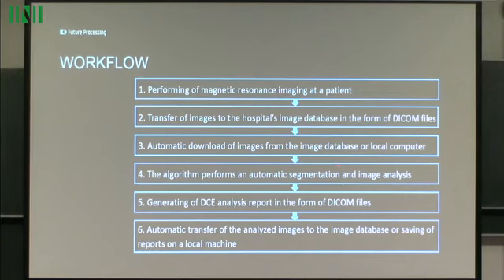After acquiring the data, we want to process the data and we want to do it in place, so in the hospital. No transfer of data, as Lawrence asked Alex. We are not interested in transferring data because it's basically difficult in that kind of scenario. And finally, after this automated analysis, we want to have a report that might be read anywhere, anytime.